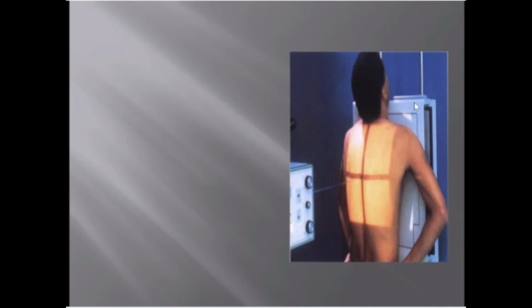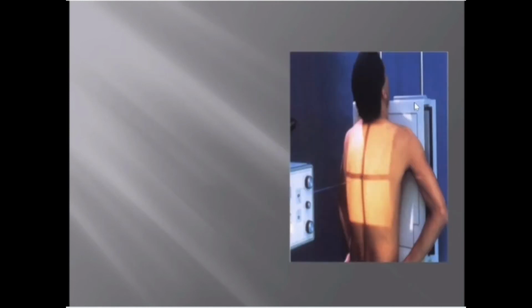mid-sagittal plane is vertical. Ask the patient to flex the arms to rest the backs of the hands low on the hips, below the level of the costophrenic angles. This maneuver rotates the scapulae laterally so that they are not superimposed over the lungs. Depress the shoulders and adjust them to lie in the same transverse plane. Rotate them forward to position them below the lung apices.